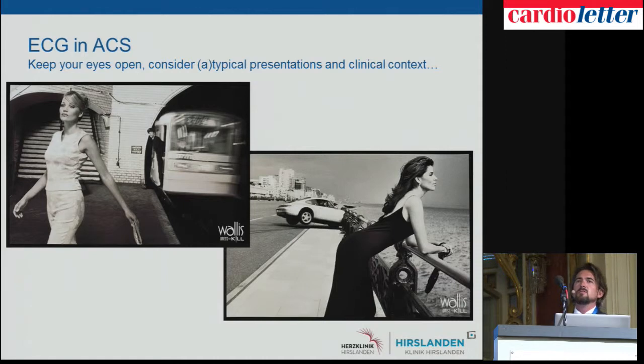As a take-home message, ECG in ACS: keep your eyes open, consider typical and atypical ECG presentation, and always put it in a clinical context.